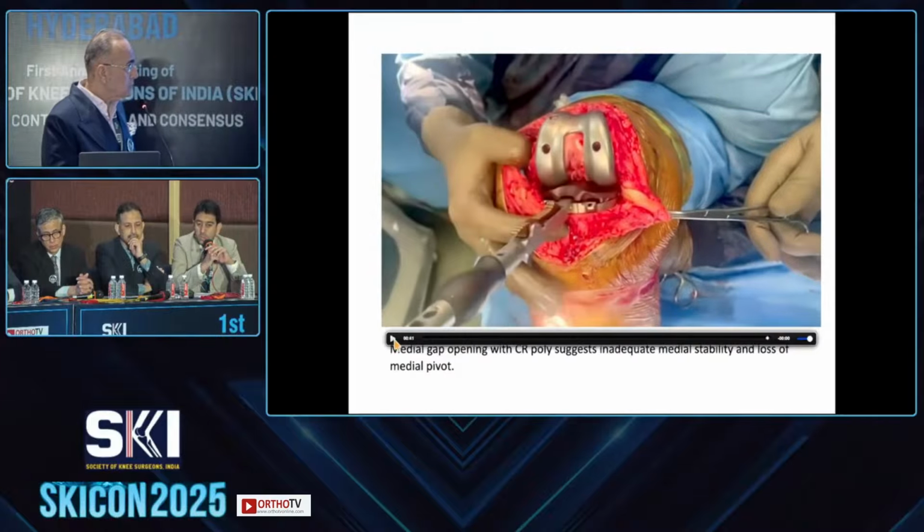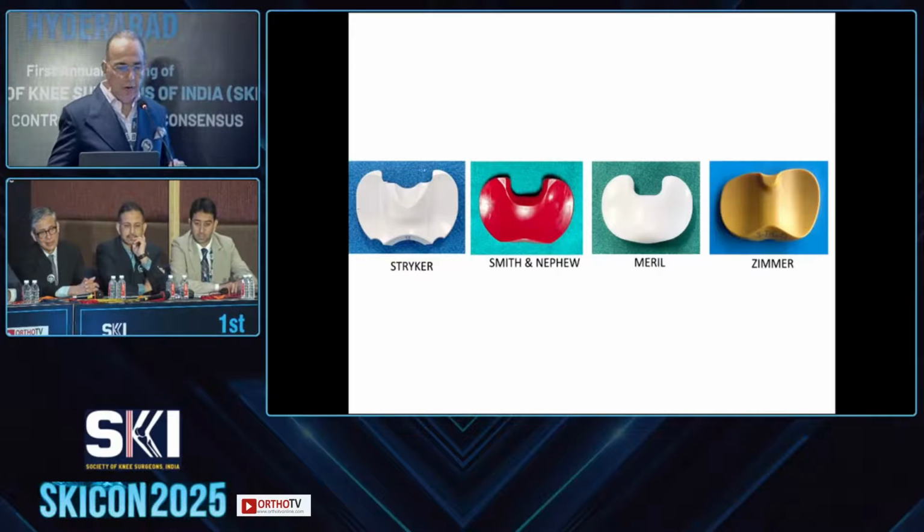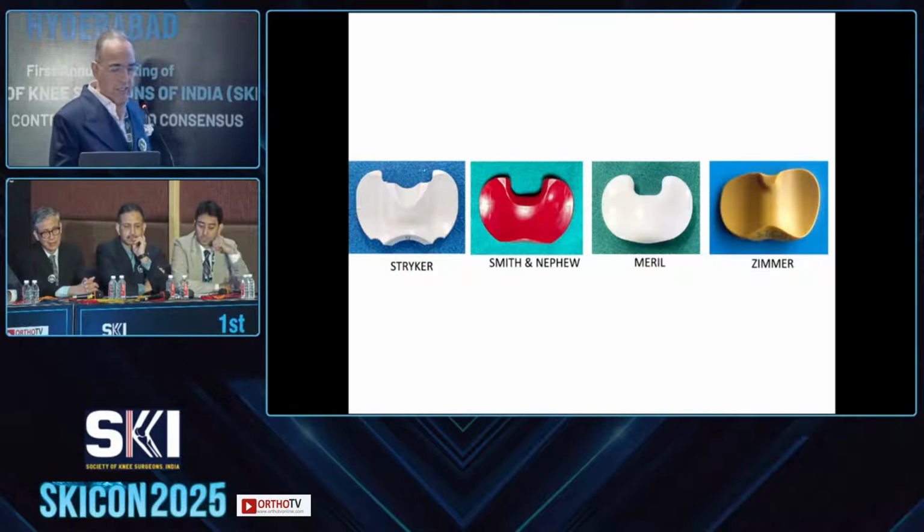I think it's not too bad, sir. I think it's not coming out completely, so I would actually accept this. You would accept this? Yeah, I would accept that. All right, okay, fine. But I would do a CS kind of an insert here.